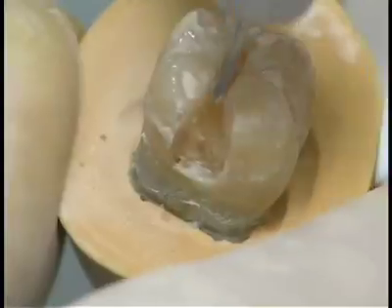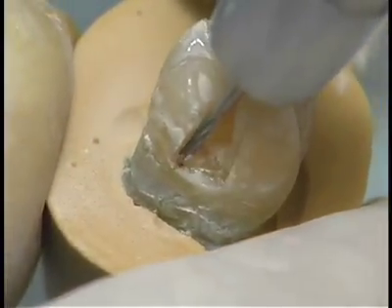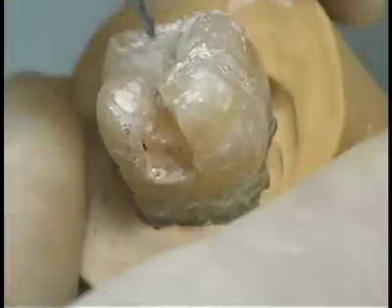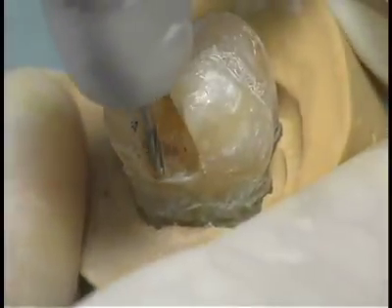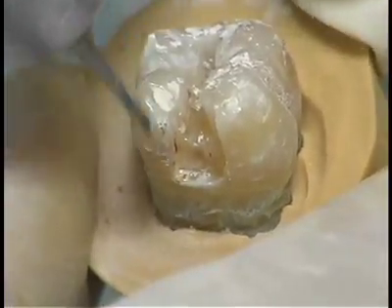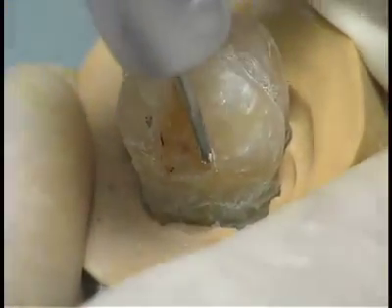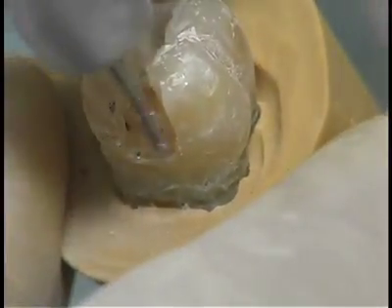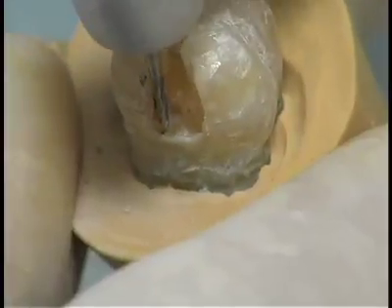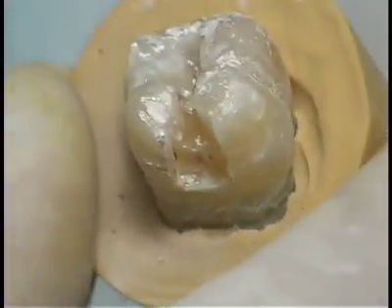After the proximal segment is developed, the following are seen. 1. The buccoproximal and lingual proximal walls are 90 degrees to the tangent of the tooth structure. 2. The bucco and lingual proximal walls are parallel to the enamel rod direction. 3. The buccoproximal wall makes an acute angle with the gingival floor, and the lingual proximal wall makes a less acute angle. 4. The flare or divergence angle is 90 degrees to the tangent of the tooth.